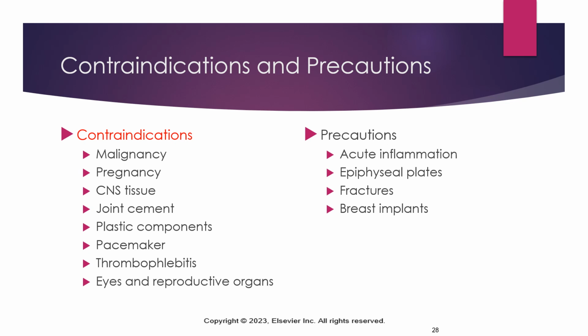We're going to ask them if they have a pacemaker or any type of implantable cardiac device. We're not trying to mess with that either, so stay away from those.